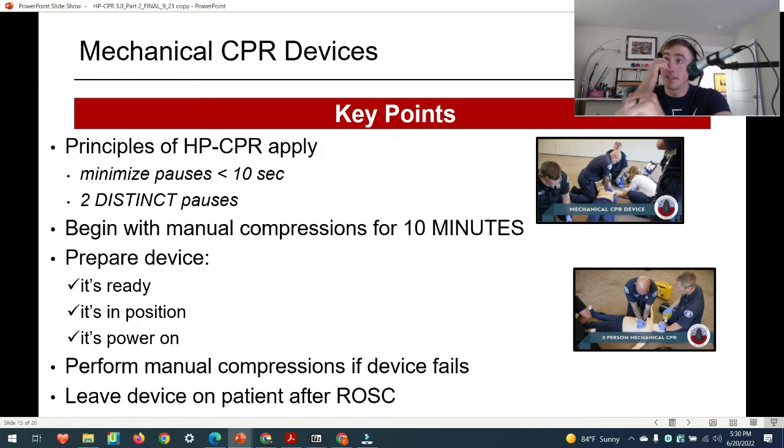Then you connect it, and when you're ready, you use your 2 fingers around the suction cup, 1 finger on the buttons, ready to go 1, 2, 3, or actually 2, 3. Number 1 should already be on. You pull it down, pause, start. All right, and hopefully you don't have to readjust it because the puck wasn't lined up to begin with, or you forgot to use the neck strap, so now the darn thing's moving down the chest.